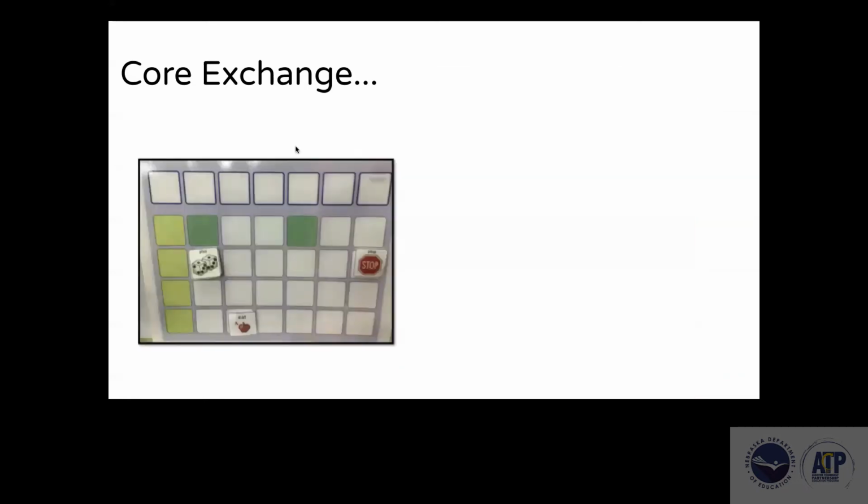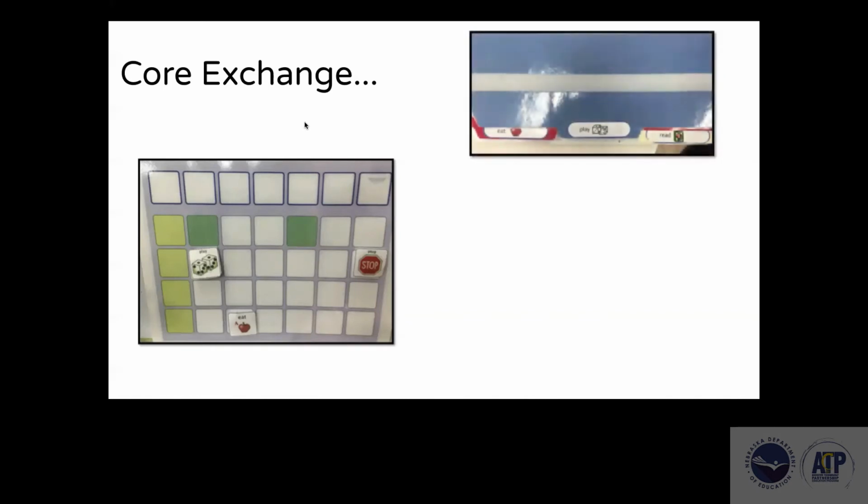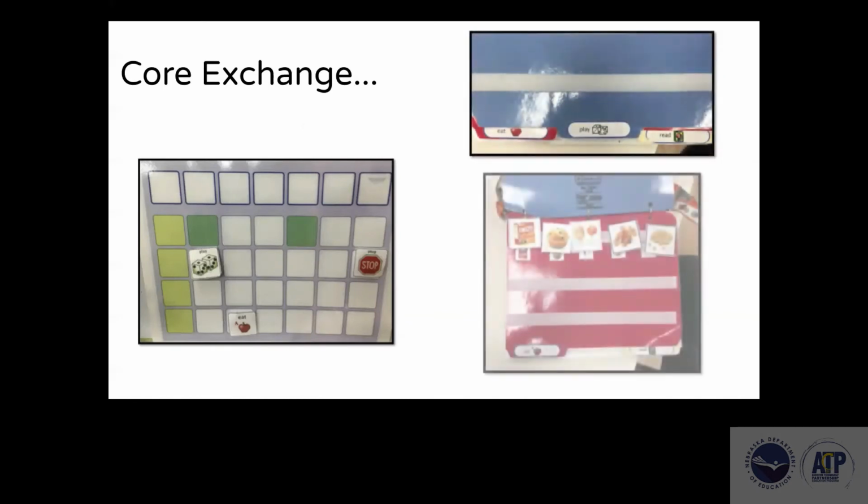We've also done it where the front is actually a core board. This one is one where a student was just starting out. And so the core board has, they know to put the icons right back where they were on the core board, so they can start learning that motor memory. And then eventually, of course, move to a device. And then inside, like the other one, the tabs are all based on those core words, and their personal fringe is then under each one of those tabs.